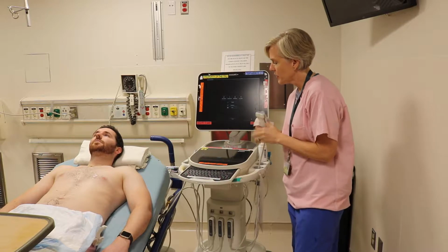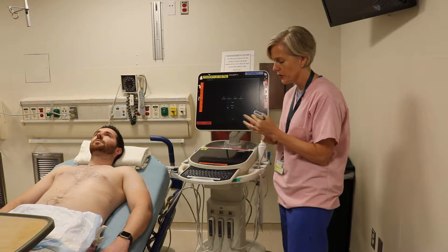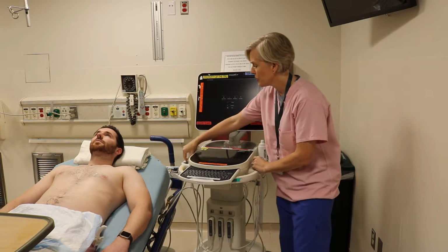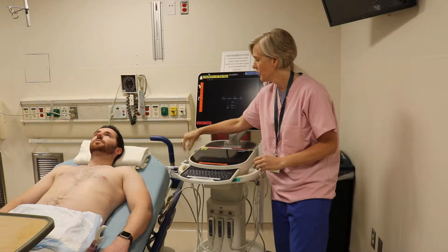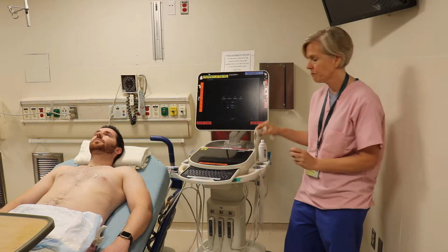An ultrasound system, generally these point-of-care ultrasound systems have usually 3 different probes. You have 2 low-frequency probes. You have your phased array and your curvilinear probe. And then you have a high-frequency probe.